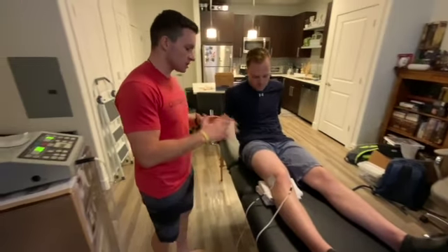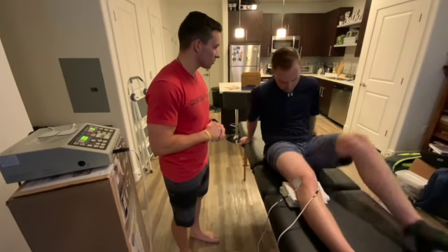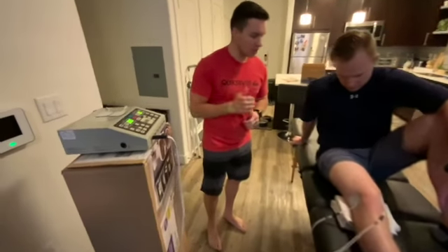Okay. So once it gets up to the point where you feel a comfortable tingle, then we'll be good, and we can just leave it right there. And we'll go for about 20 minutes on here. Is that okay? Yeah, that's fine. Okay, perfect. So let me get this thing set up, and then we'll start it up, okay?